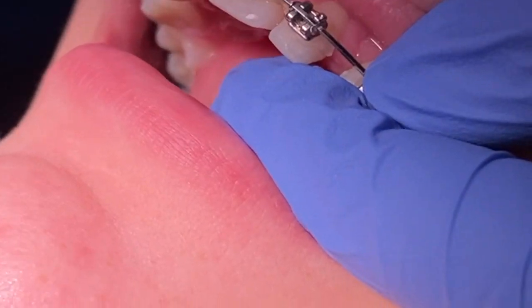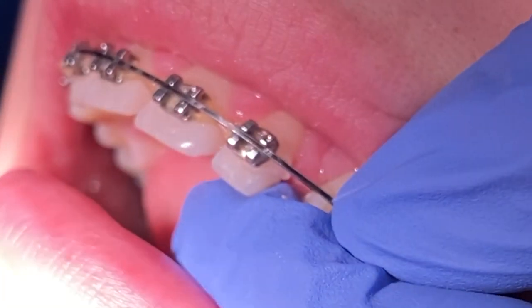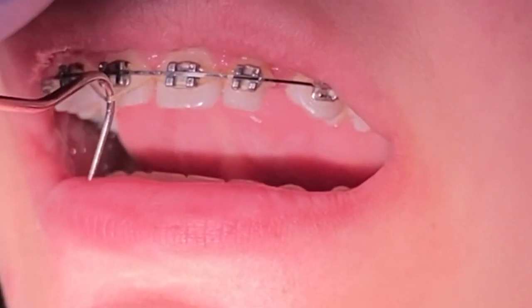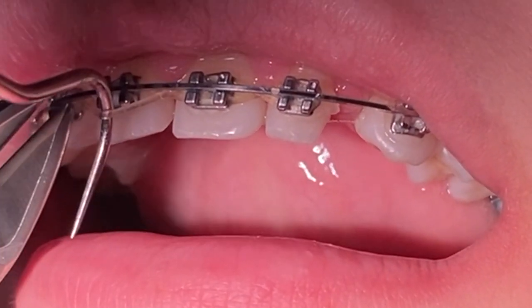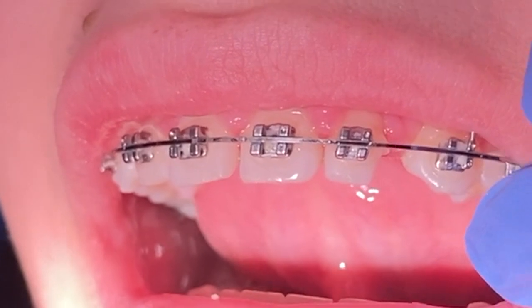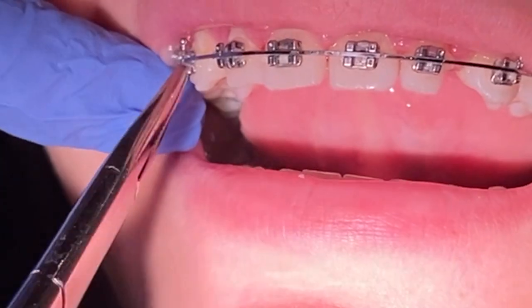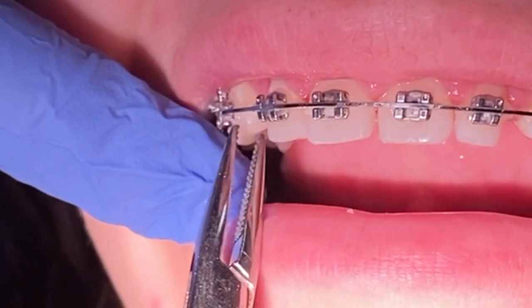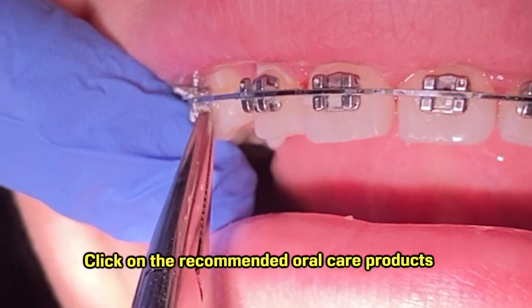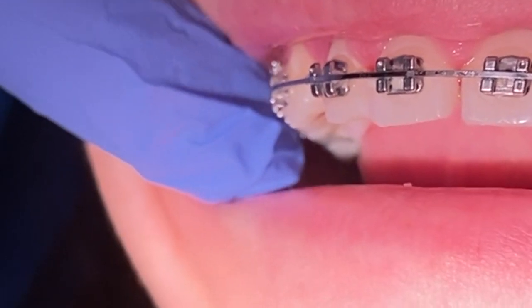As you can see here, we are removing what we call an infinity football lace tie. In this patient it went from the upper two-to-two, which is from your upper left lateral to your upper right lateral. What this is doing is helping create an anchor, preventing any shifting of those particular teeth as we're aligning and shifting other teeth in the mouth. This is placed underneath the wire. What often happens in this case is that you tend to create a lot of plaque accumulation and food debris, so you always have to make sure you use those home care recommended products — we will link them below in our storefront.